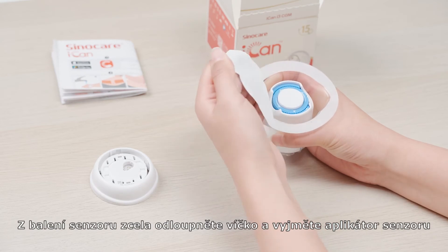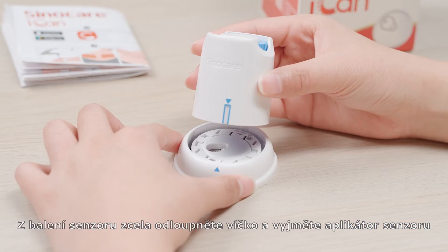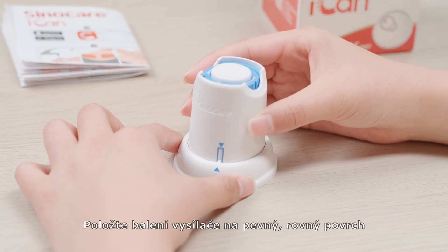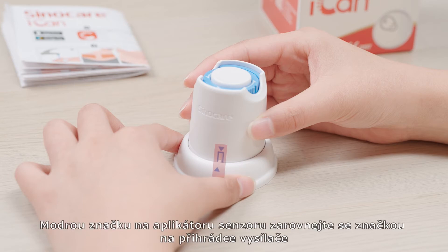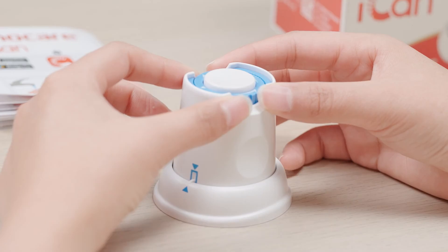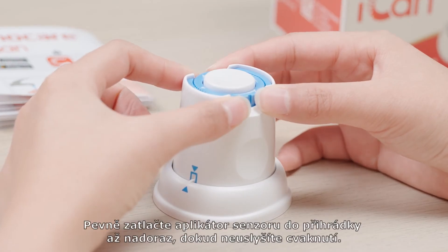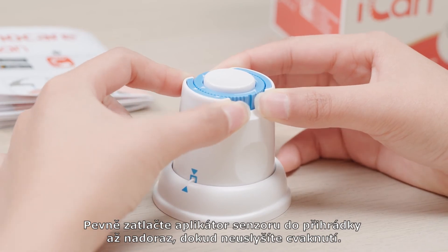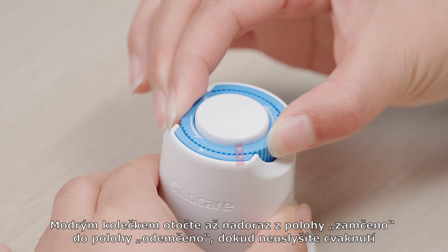Peel the lid completely off the sensor pack and take out the sensor applicator. Place the transmitter pack on a hard, flat surface. Line up the blue mark on the sensor applicator with the mark on the transmitter tray. Firmly press the sensor applicator down into the tray until you hear a click and it comes to a stop. Turn the blue gear from the locked icon to the unlocked icon until you hear a click and cannot turn further.